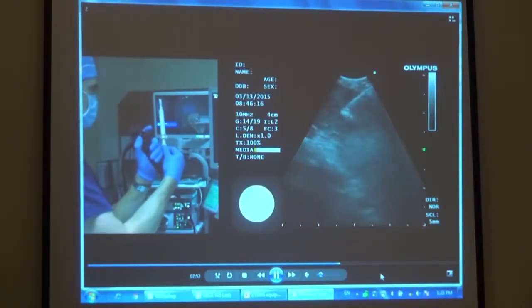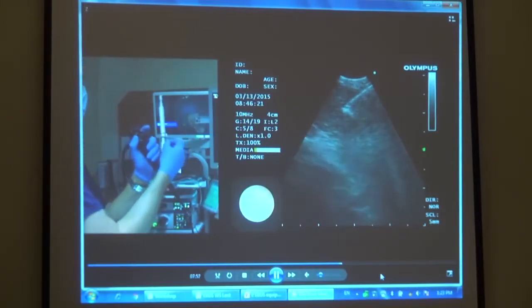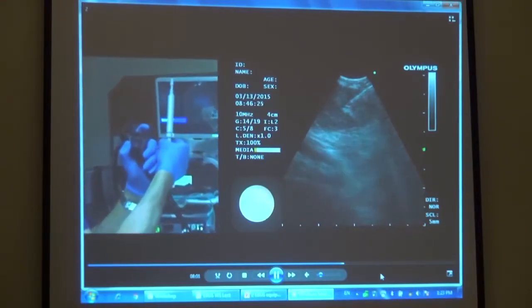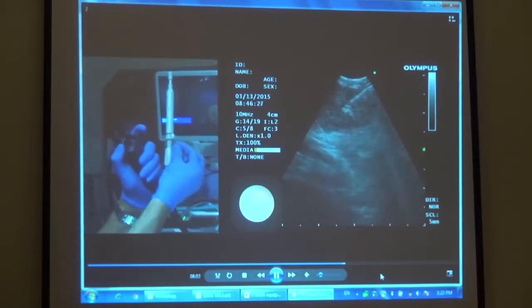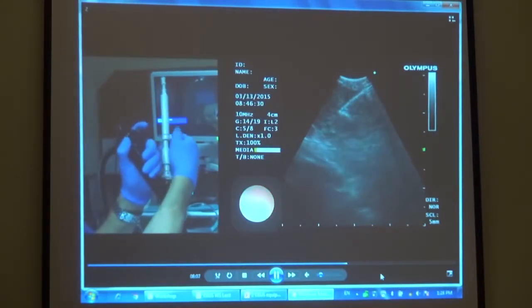By default, the needle will advance 2 centimeters from the end of the sheath, and for most applications, this is sufficient. A removable stop can be detached, which allows the needle to extend an additional 2 centimeters into the lymph node. This is useful when biopsying larger lymph nodes.